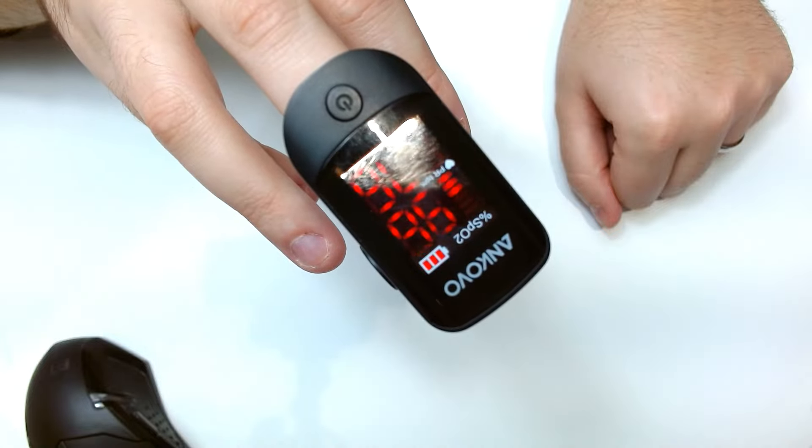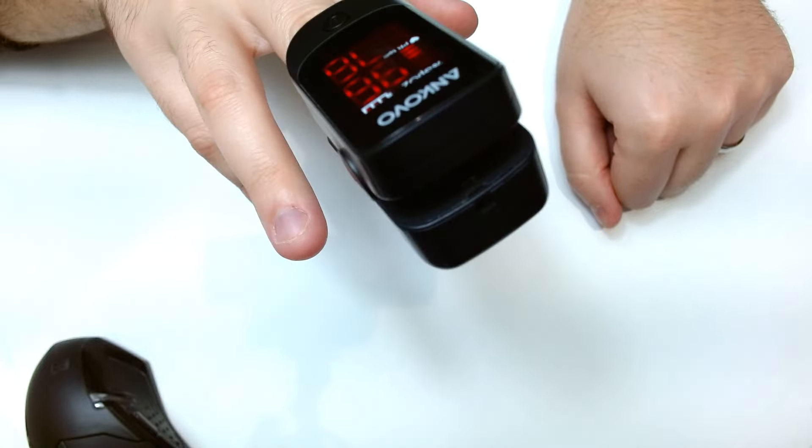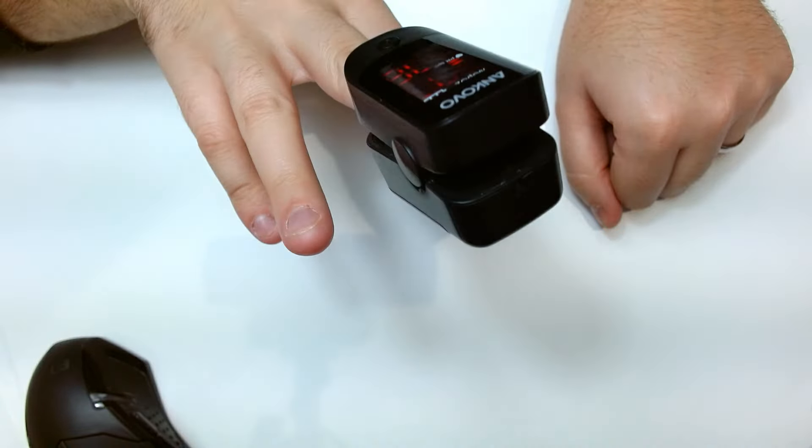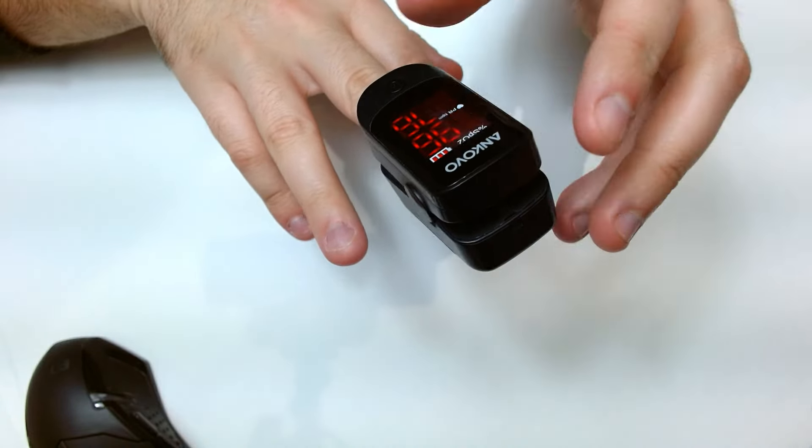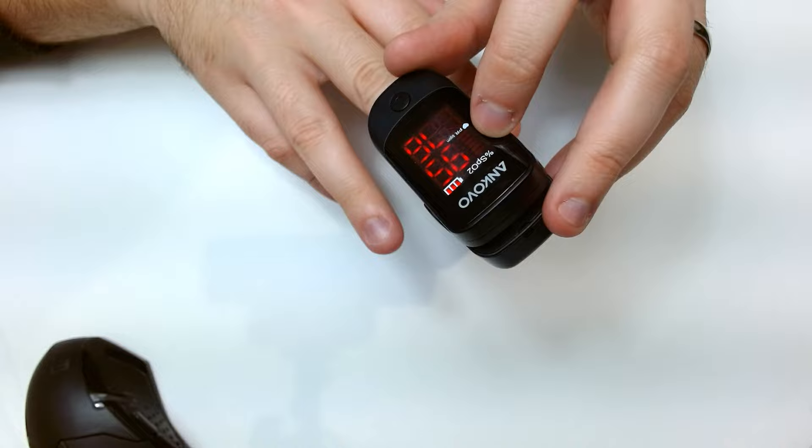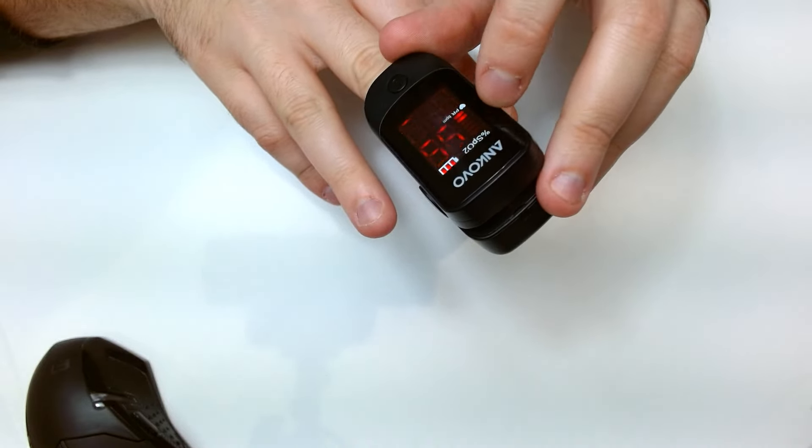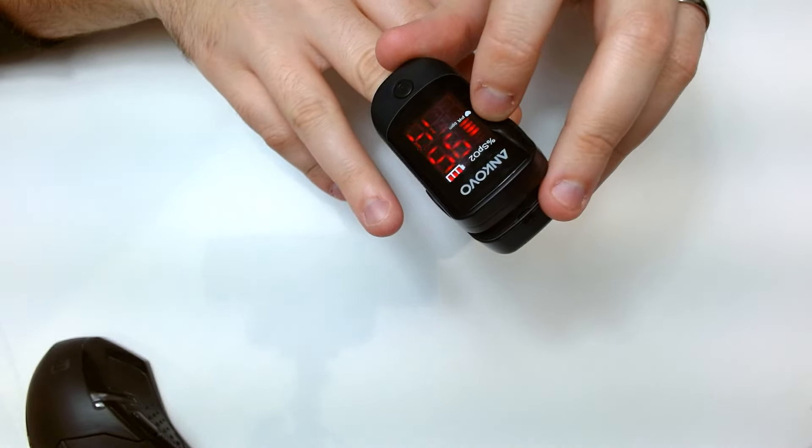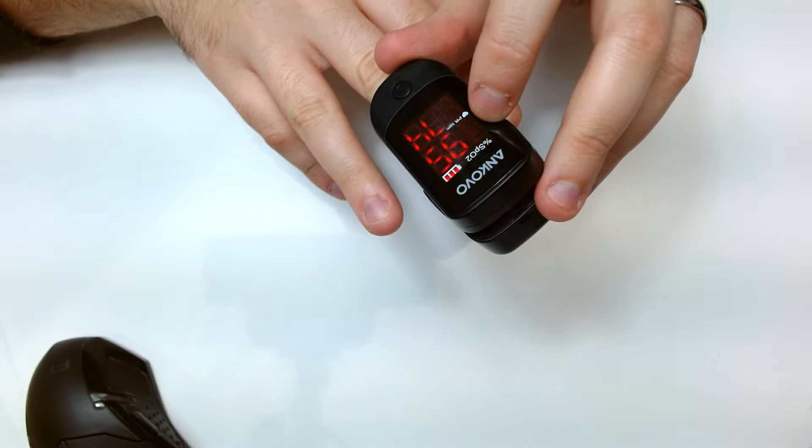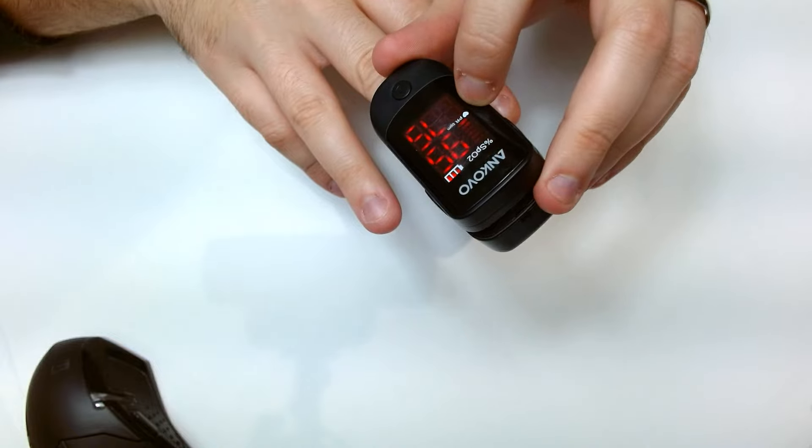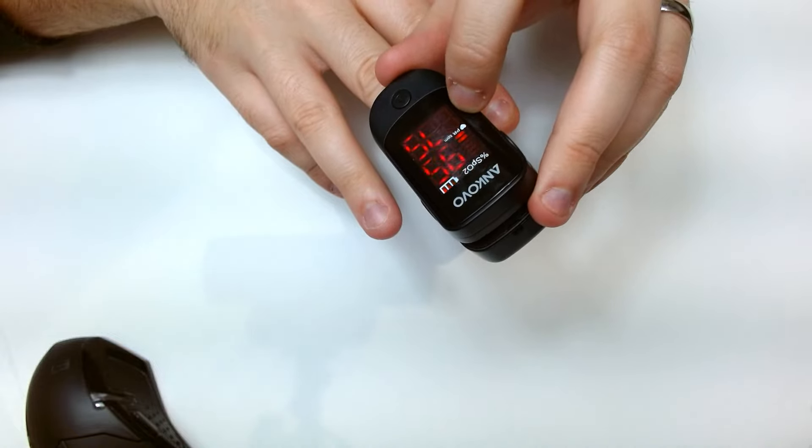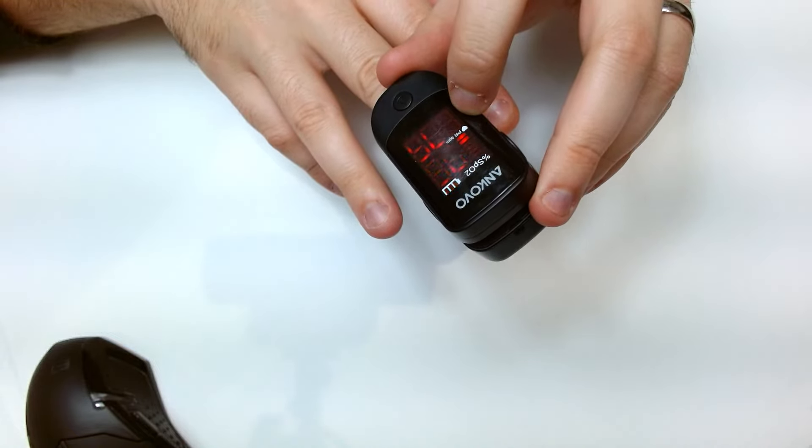So what it actually says is 96 and 76. You've got the percentage SPO2 there that reads your oxygen levels and then you've got your beats per minute which is how fast your heartbeat is going.